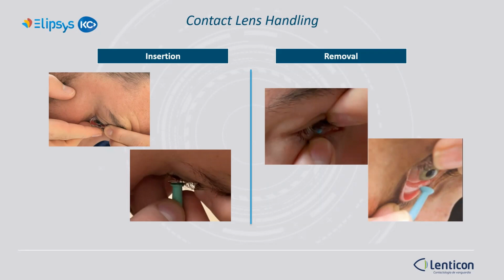With the middle finger of the dominant hand, the same hand holding the lens, pull down the lower eyelid to create enough space for the lens. While looking straight ahead or slightly downwards, gently place the lens directly onto the center of the eye.